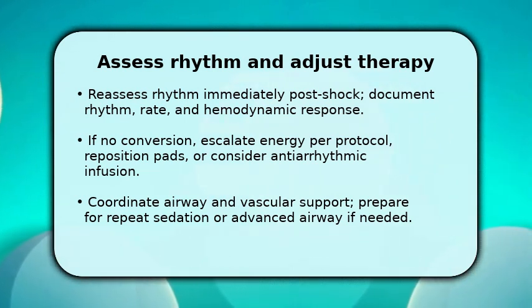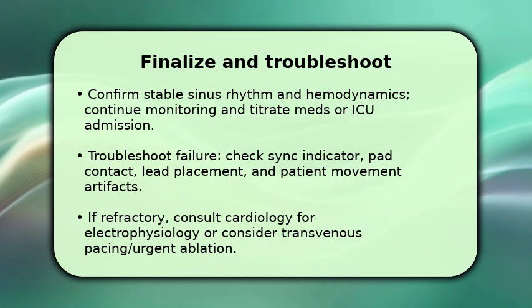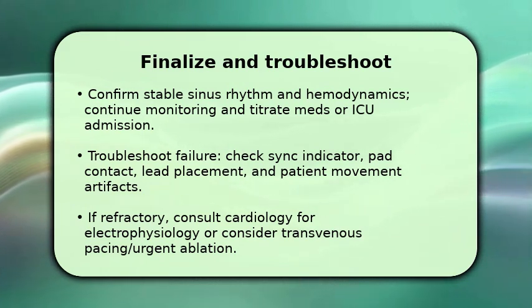You must ensure the patient is stable after conversion. Secure airway, optimize blood pressure, and arrange continuous monitoring and admission. If synchronized shocks repeatedly fail, troubleshoot methodically.